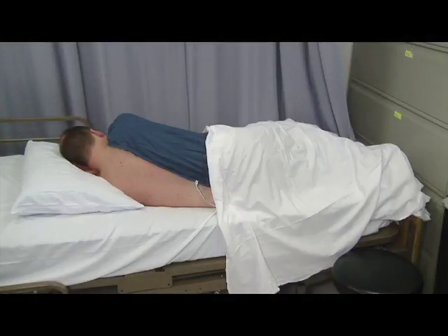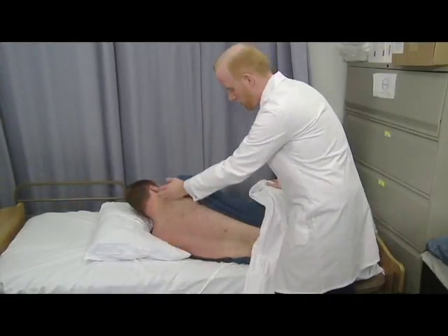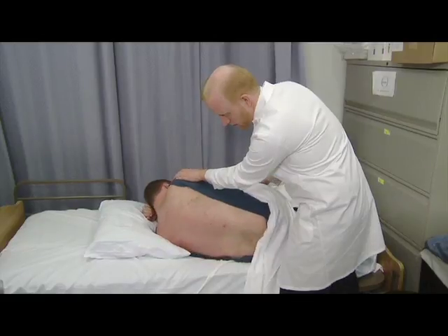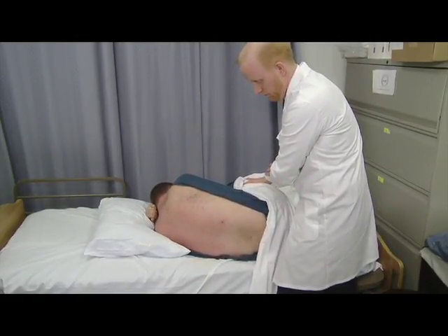The lumbar puncture is generally done at the bedside with the patient in the lateral recumbent position. Alternatively, the patient may be seated on the side of the bed, leaning over a table or pillow. Use this position if measurement of the opening pressure is not required or if the patient is unable to lie flat. Instruct the patient to curl into a fetal position and arch their back toward you to help separate the spinous processes to allow for passage of the needle.